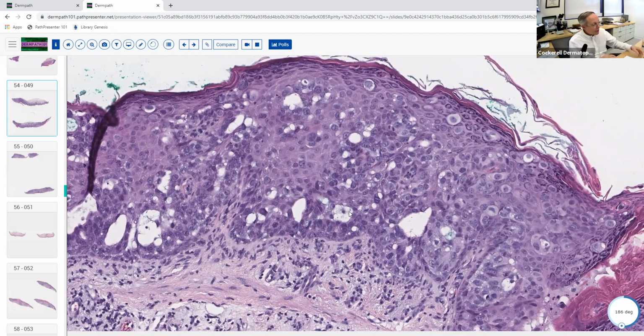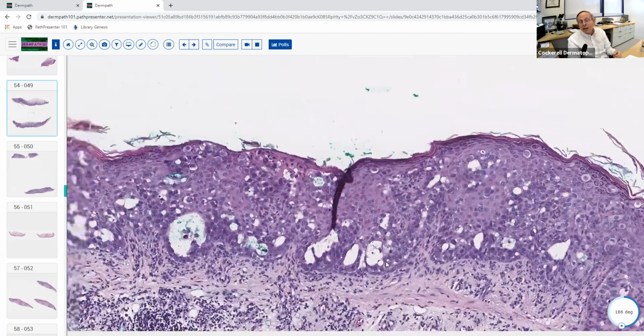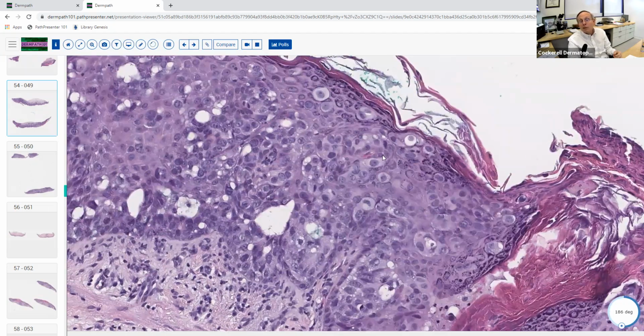So you have a choice here. 57-year-old woman with multiple erythematous papules on her chest, okay, chest, woman, 57. The best diagnosis here is going to be Paget's disease, in this case of the breast. And what's happening here is you've got underlying intraductal breast carcinoma that has spread all the way from the breast into the epidermis. In this case, it's got this glandular epithelium within the epidermis. That's actually relatively uncommon. Usually it looks more like this, where we just get all these cells that have large, abundant cytoplasm with a rim of normal remaining epithelium at the base throughout the epithelium.